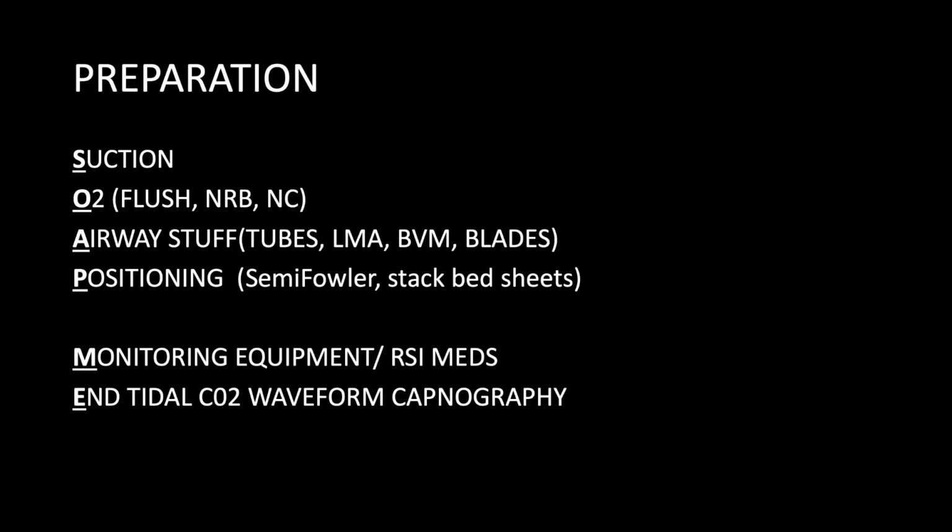First off, starting with preparation, and this is, do I have the minimum standard level of equipment that I would require to perform laryngoscopy, deliver a tube, rescue myself from a difficult situation, provide adequate oxygenation and ventilation for a patient during the procedure. So this essentially boils down to all the stuff that you're going to need.